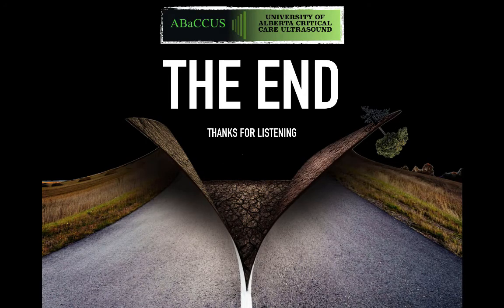As you've seen and heard, LVEF assessment has significant pitfalls that can be avoided if the bedside sonographer is aware of them and takes the clinical picture into context.